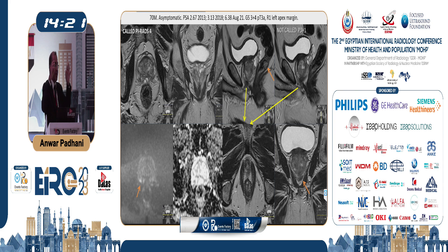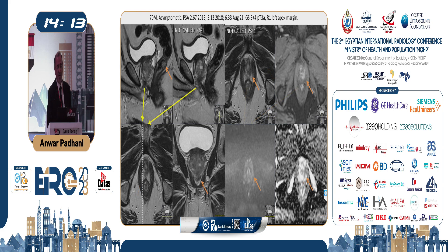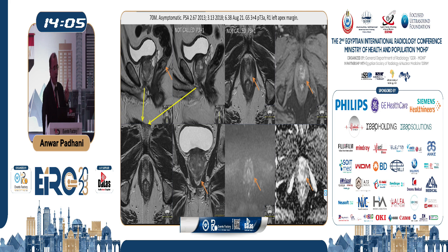The radiologist has developed what's called satisfaction of search. He has seen one small lesion and a rectal polyp, but he has missed the PIRADS 4 lesion at the apex — it is not hyperintense on the high B-value image, but you can see it enhances briskly, making it in fact a PIRADS 4 lesion.